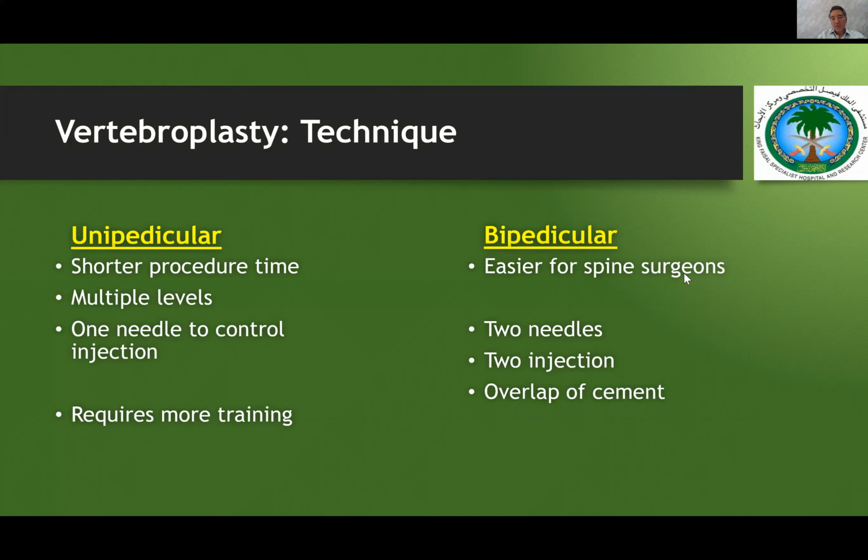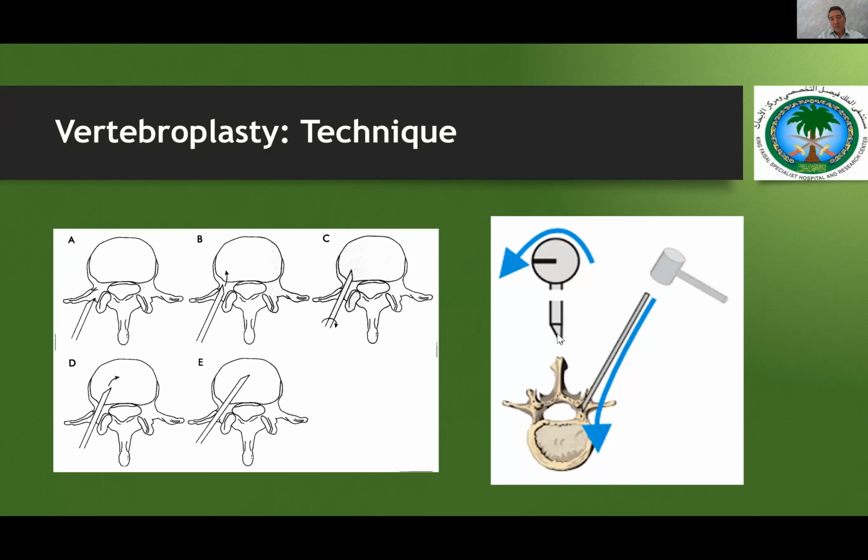Now, in this slide, I want you to pay attention. For all these needles, I definitely always like to use the bevel, and the marker is always where the bevel ends. If you hammer, the needle will direct itself toward the opposite side. So if the bevel side is here, the needle is going to go to the lateral aspect. This is very important to you.